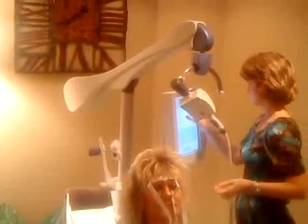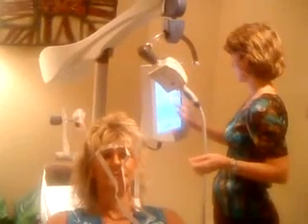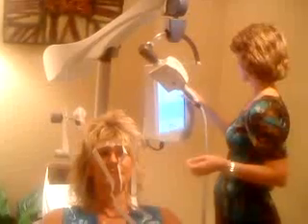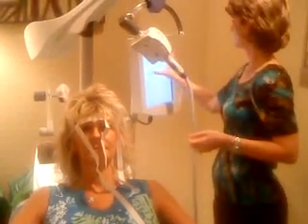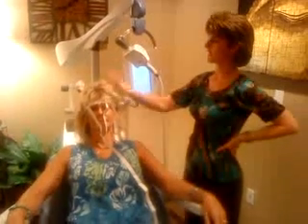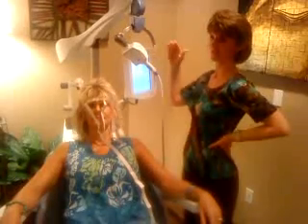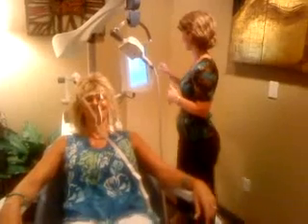Once it pops in, we just test it to make sure it's working. This will sound a little louder because it's not against the head — you're just hearing it tap. So don't be scared by that.